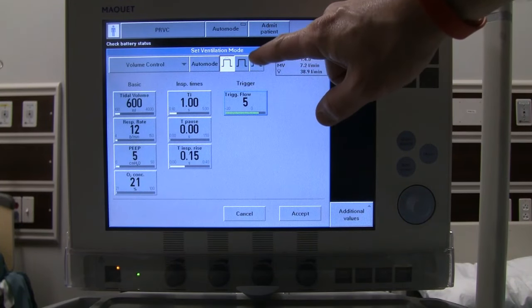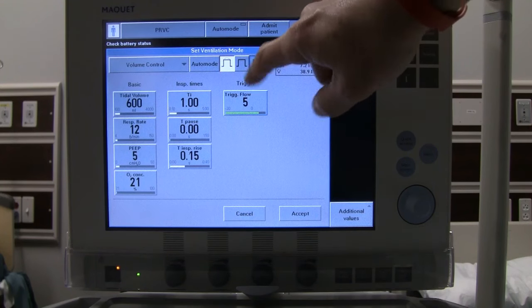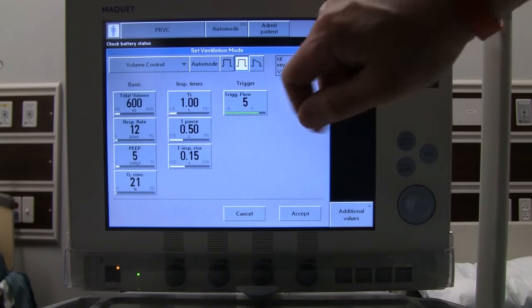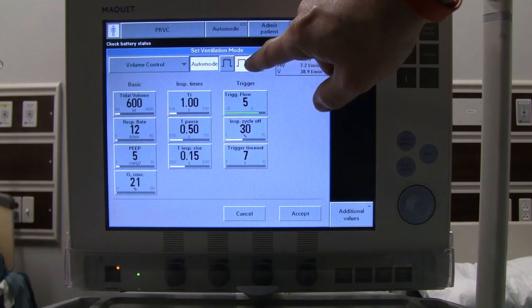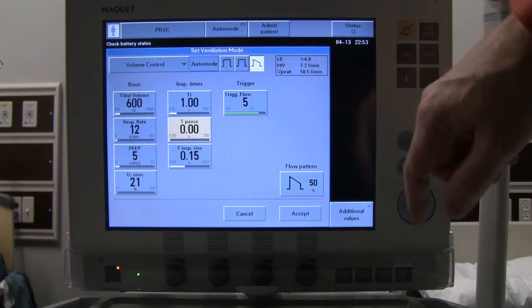At the top you'll notice different wave flow options: a descending pattern, a square wave (which is generally not comfortable for patients), and an auto mode. Auto mode starts in controlled ventilation and can automatically switch based on patient trigger — if they're triggering breaths it allows smoother spontaneous breathing. The transitions are managed by McKay's servo algorithms, so if you want full control over flow delivery, use one of the set wave flow patterns instead.